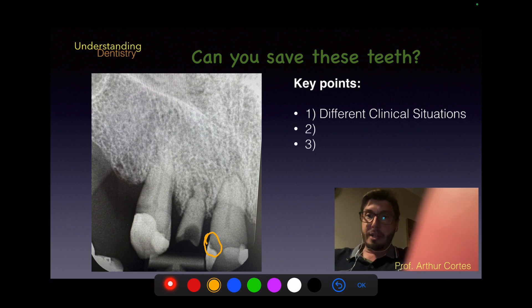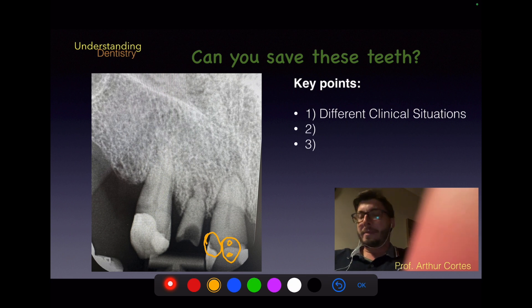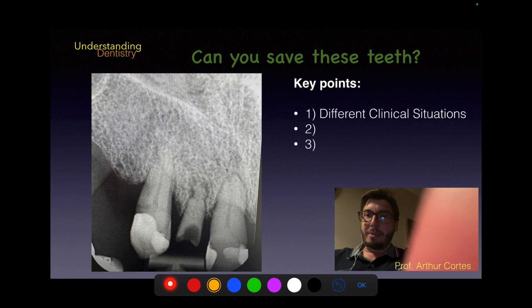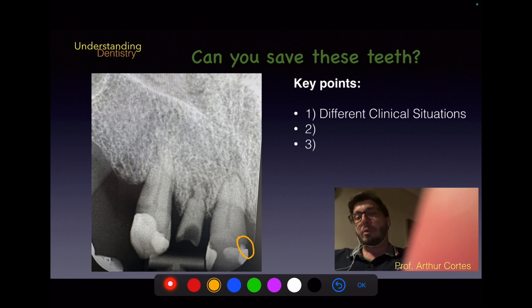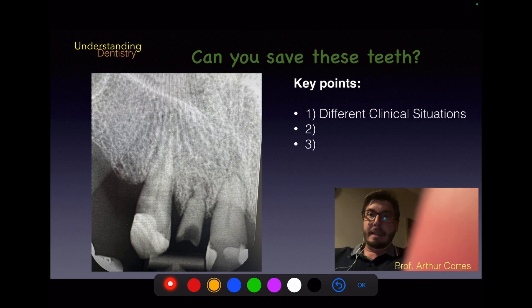This radiolucent line can appear when too much bonding or primer material is placed — so it depends on the clinical procedure. There's also a very thin radiolucent line between the restoration and dentine, which could simply be the thickness of a liner, bond, or primer. Additionally, there is a lack of adaptation of the restoration — possibly the matrix was not used properly. This could be monitored depending on the clinical situation.